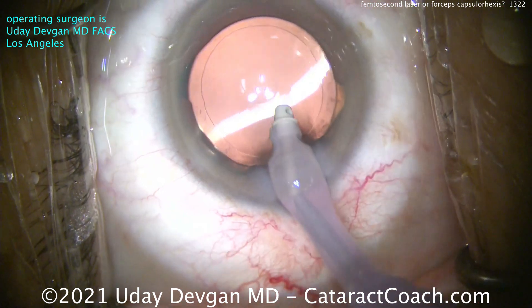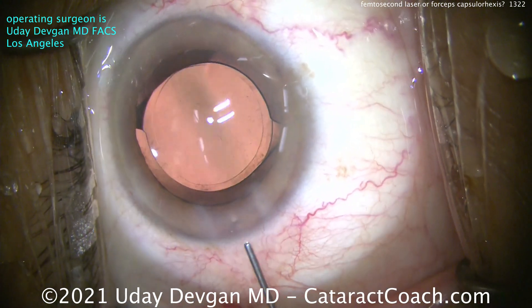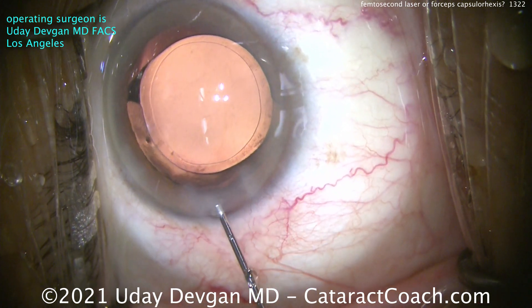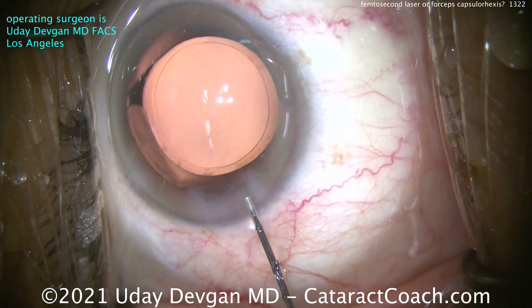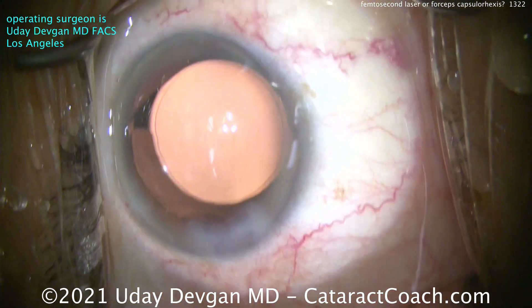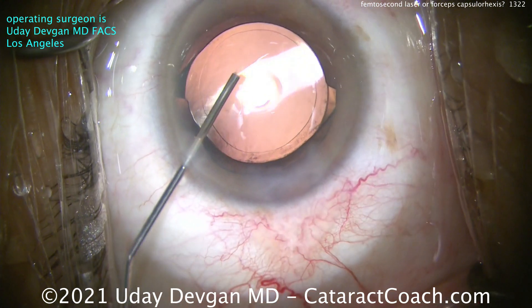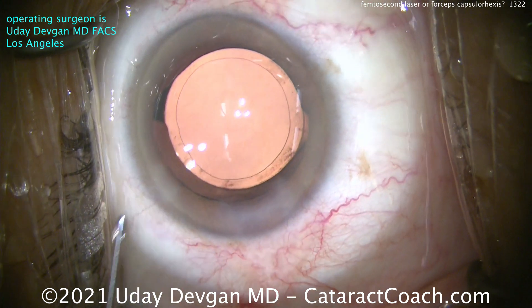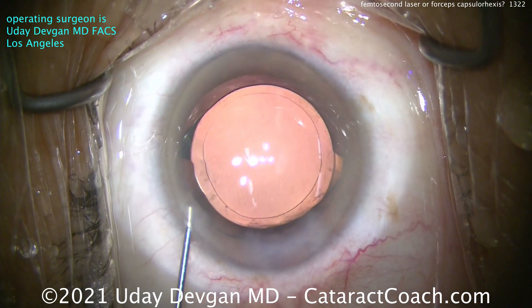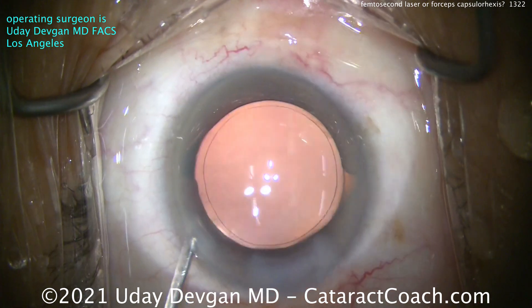Sometimes it helps to think from a different perspective. What if the norm was to use a half-million dollar laser to make a capsular opening? And then someone invented forceps — available for a few hundred to a thousand dollars — and you can make an equally good or sometimes even better opening just with these forceps. You'd say, wow, what an improvement. For one five-hundredth the cost, you can achieve the same thing.